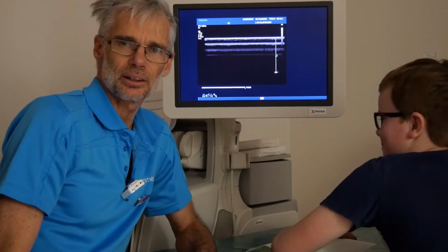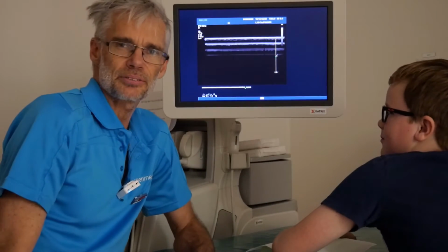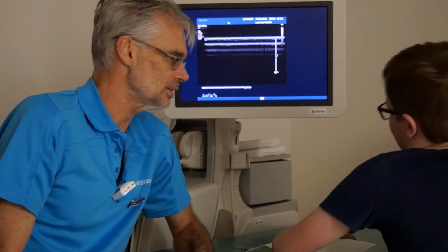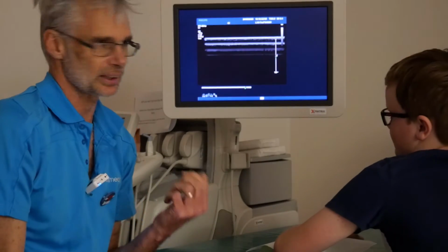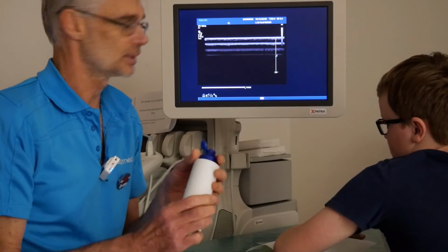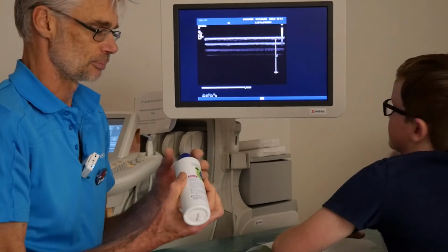So a lot of our work is acute fracture care, and Hayden's back after 10 days. He's got a fracture of his distal radius. That's the end of the radius, Hayden, and he's come back for a check. We're taking the cast off and doing a position check because he had a fall on the cast and we like to make sure it hasn't displaced. Instead of sending for an x-ray, we like to just put the scan on.